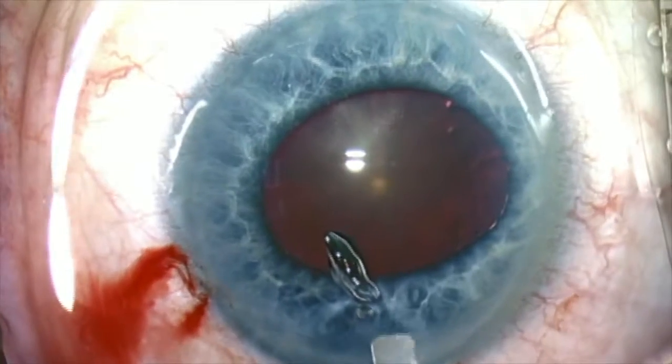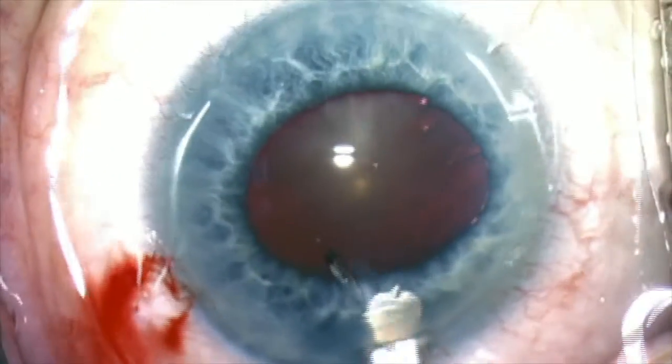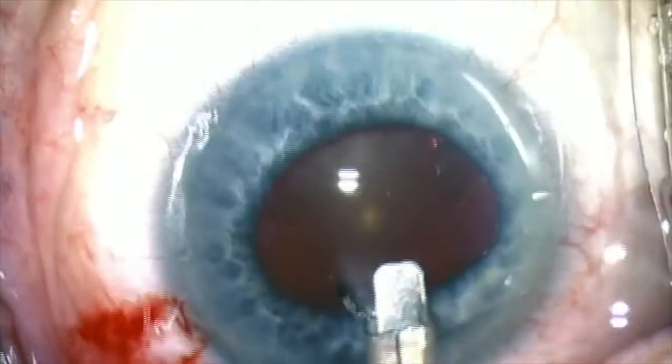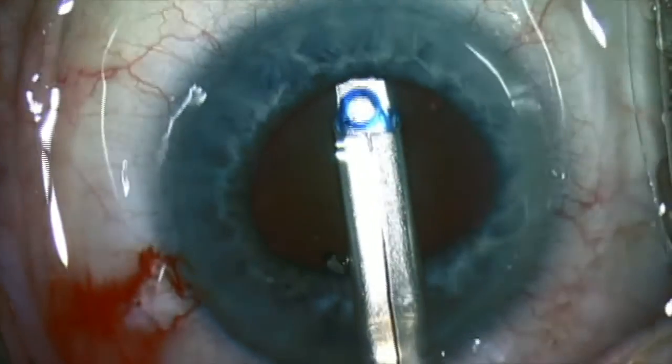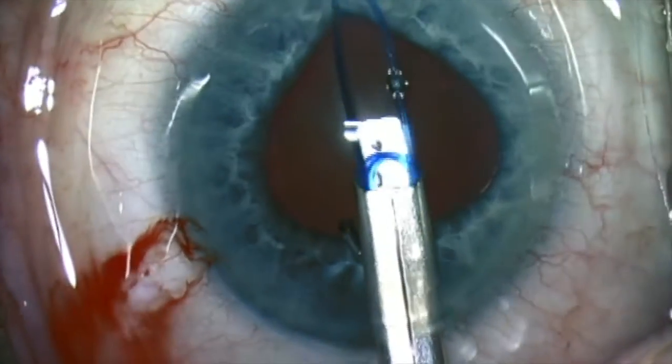Here I'm using OVD — in this case Helon 5 — and I put a small amount under the iris, between the posterior surface of the iris and the anterior capsule.